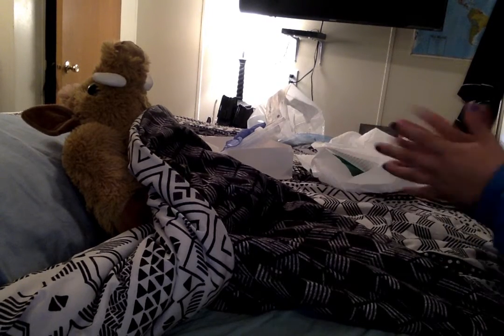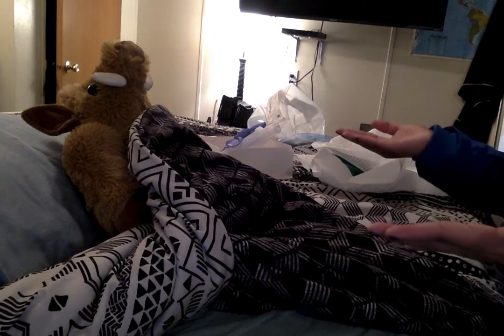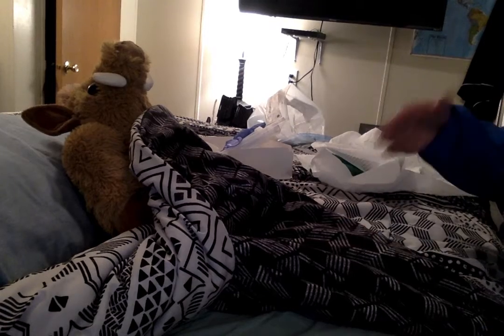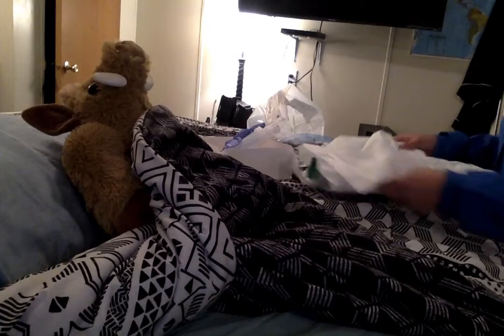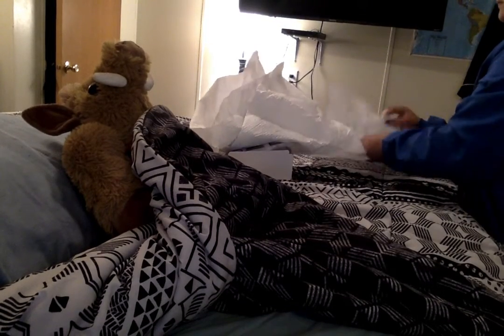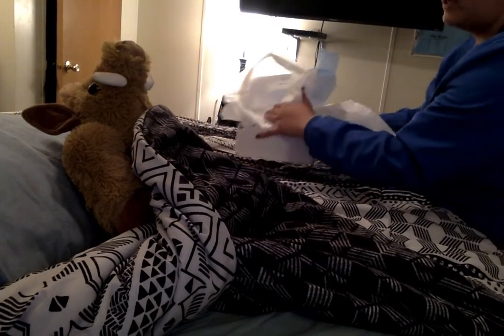I'm going to raise the appropriate number of side rails. I'm going to lower the bed into the lowest locked position. I'm going to dispose of all the supplies in the appropriate receptacles. So all of this is going into the trash. I'm going to leave the patient's room nice and tidy.